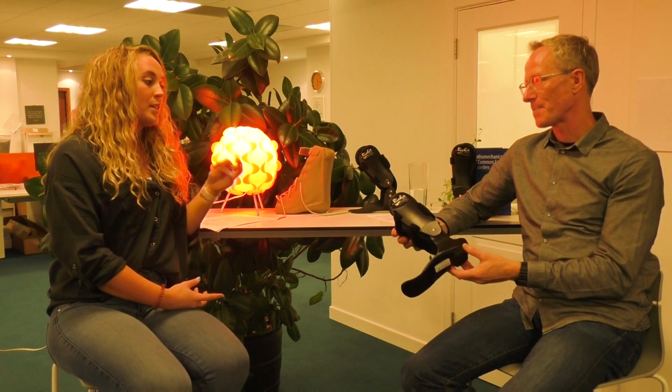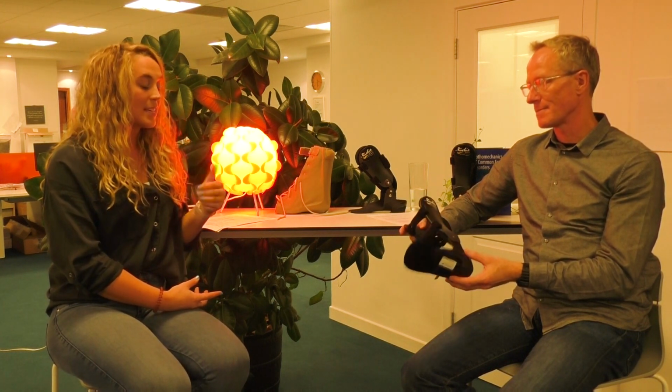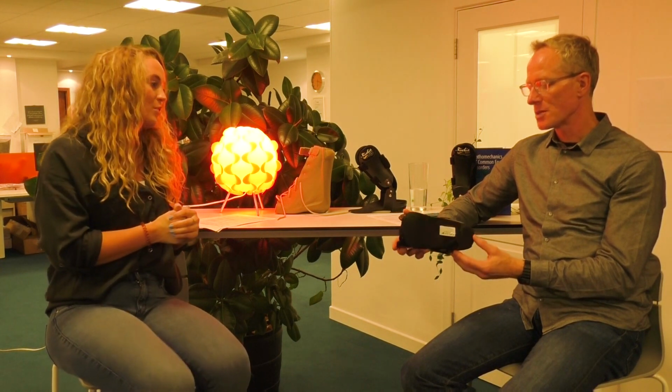skive. The skives typically are in millimeters, so that's 2, 4 or 6 millimeters. Yeah, and you're really lucky because there already is a deep heel cup, so you can go for that 6 millimeter Kirby skive because the device is already a certain width and deep heel cup. So, it gives you a chance to do that.